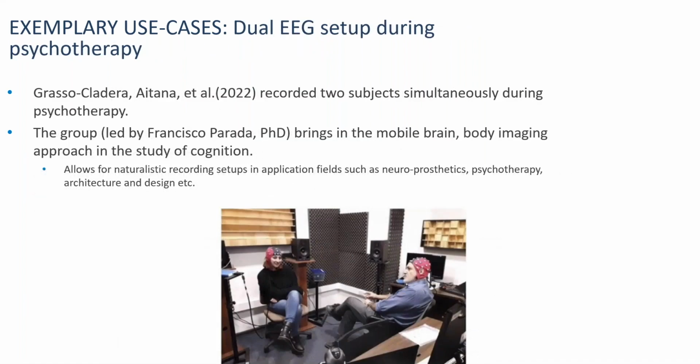The final use case that I have here is more a review article than a study itself, but I thought it was a good idea to include it because it lends an insight into the variety of application areas where you could adopt hyperscanning studies. Now, this is a picture from the group led by Francisco Parada, where they really want to focus on bringing naturalistic settings to the lab or running more ecologically valid setups.